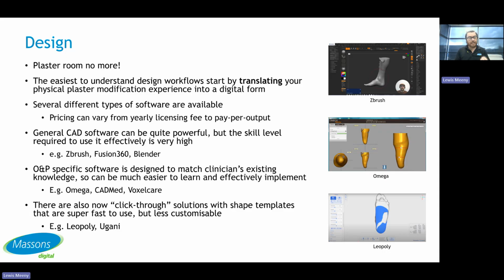They rely on really good input to get a good outcome, which is ideal, as we say, garbage in, garbage out. We need good input. But for some, like Omega or even the other software, we can do a bit more to the input than we can with some of the lower-end ones. So it's that trade-off of simplicity for how much you can do.